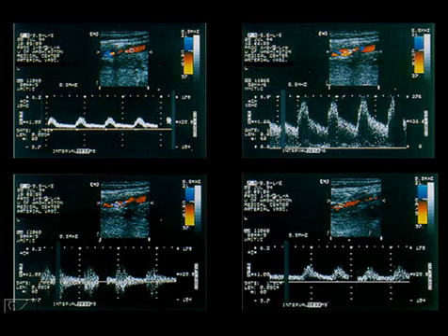Another very important feature in terms of evaluating patients with suspected stenosis is to be able to profile that stenosis, and we just wanted to go over an example of that with you in this set of 4 slides. You can see here on the top left, we are what I call in the pre-stenotic area, where we're evaluating the common carotid artery proximal to a suspected lesion right here at the origin of the internal carotid artery with acquisition of this spectral waveform.